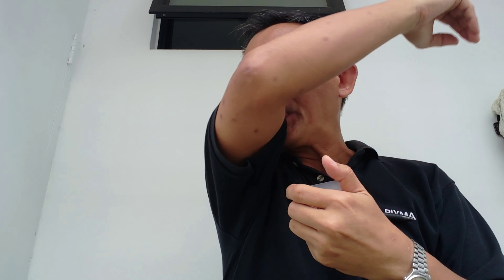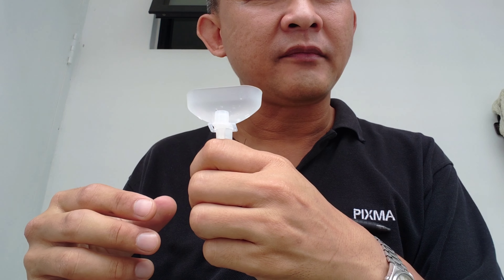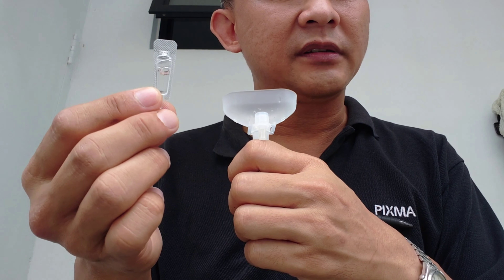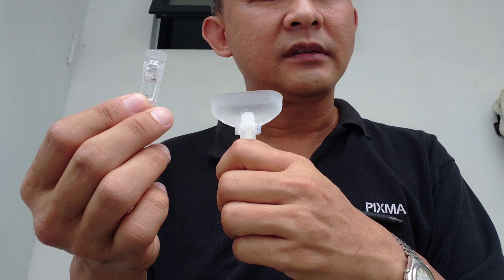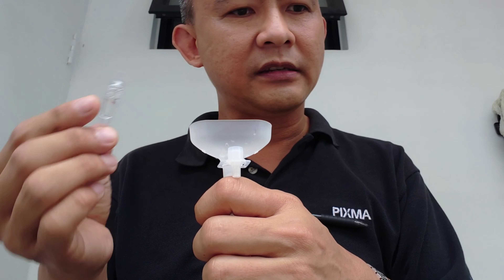Okay, okay — so disgusting! And now the entire disposable container — squeeze for things — and only place this inside of this.